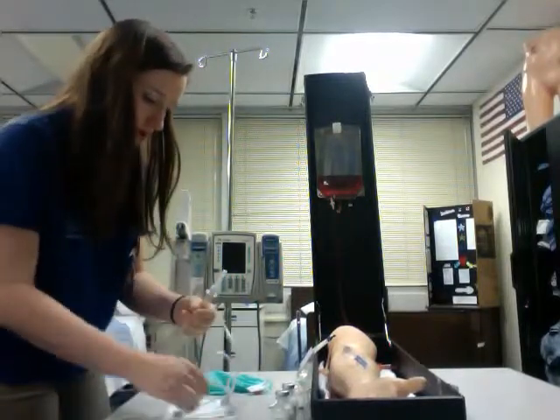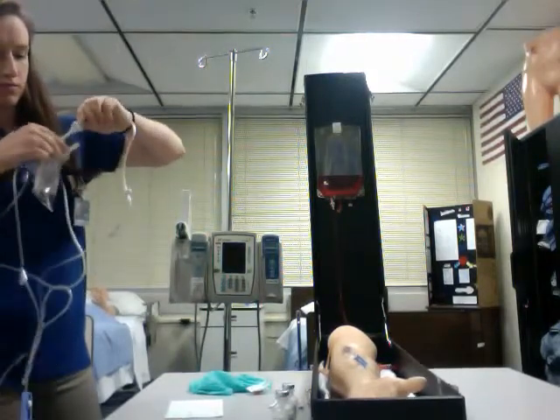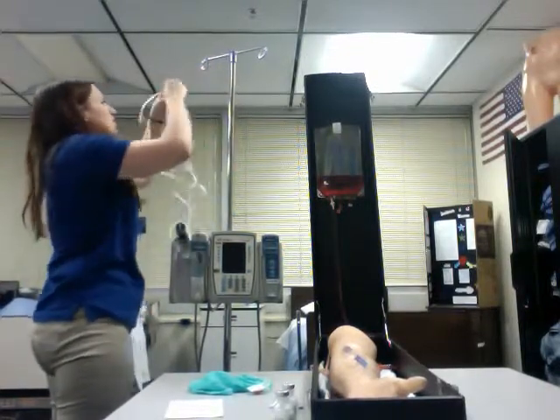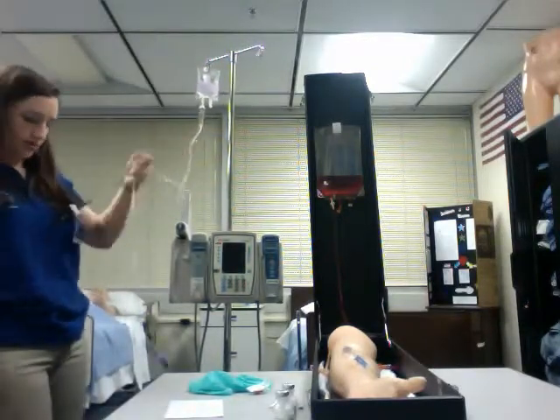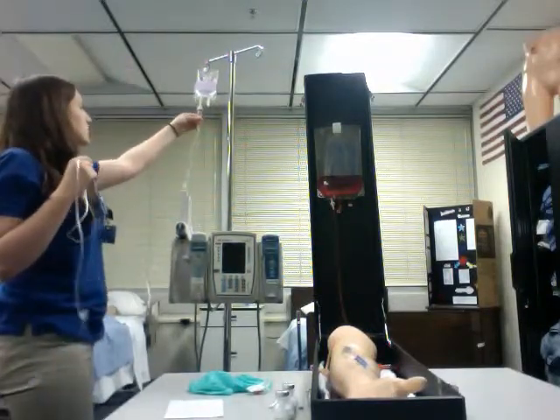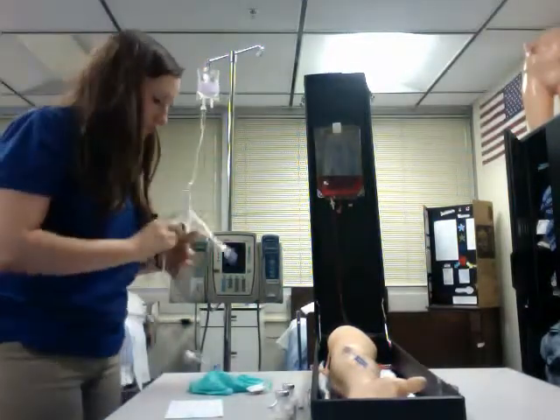I'm going to go ahead and connect the tubing to the bag. Okay. I'm going to go ahead and hang this up here so that's ready. And I need to put my tubing label on as well. That's also going to have the date, time, and initials. Okay. I'm going to go ahead and prime my tubing. Make sure there's no air bubbles in here. Alright, so now all that's ready.